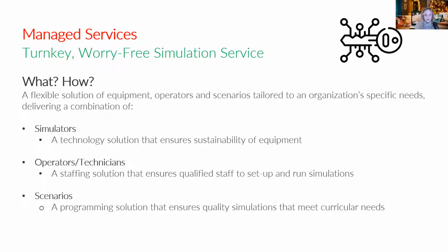Someone like Shane doesn't necessarily do this, but someone like Shane who has a really strong technical background in our simulators knows how to build scenarios and can really operate these in a super efficient way, as well as scenarios. So a programming solution that ensures that the quality of your simulations and the needs are met based on what your objectives and outcomes are.